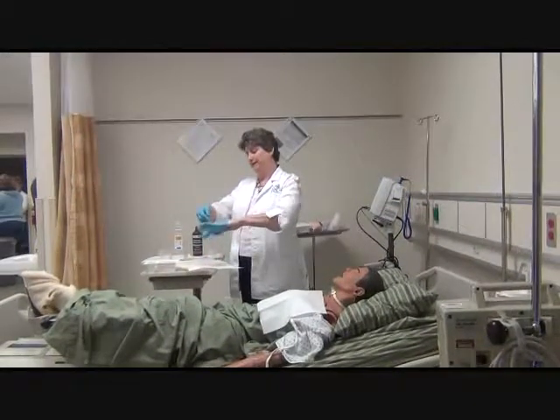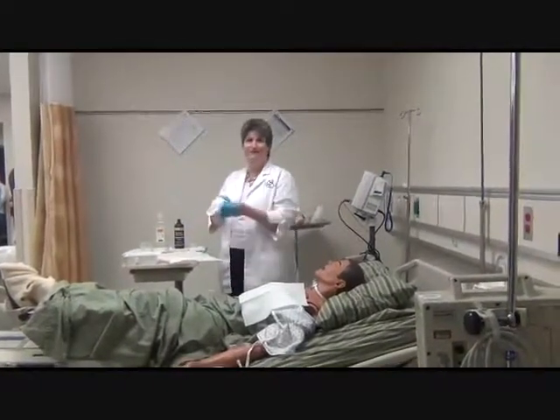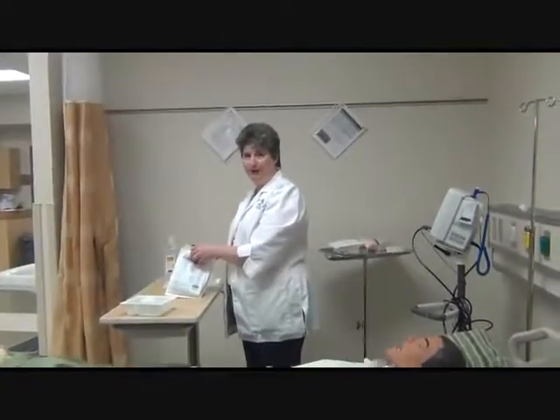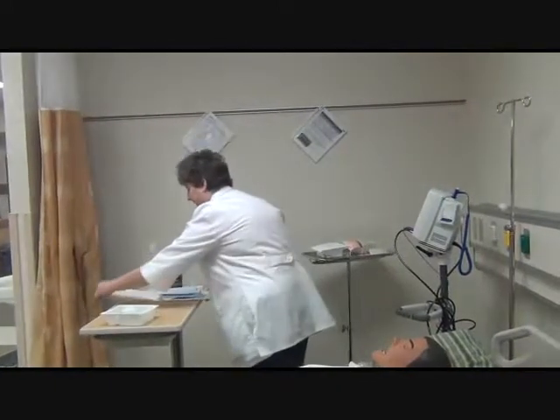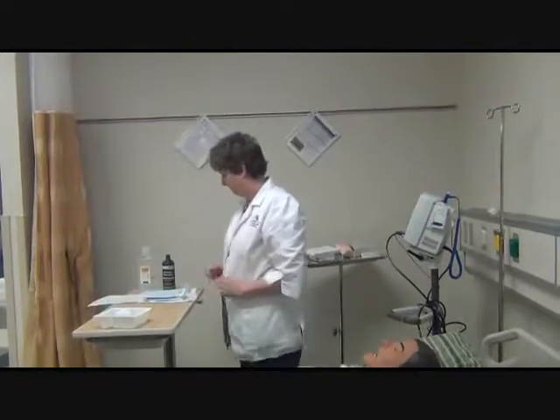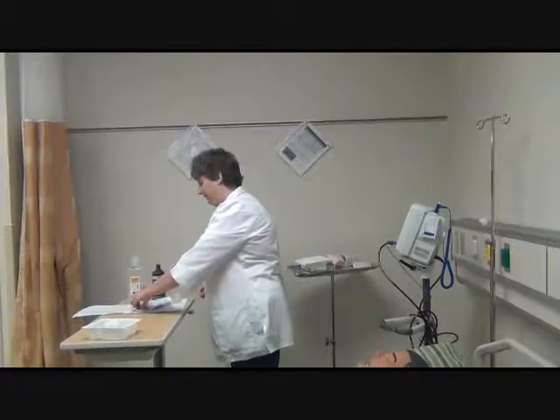I always love it when things are packed backwards, and I contaminated. So let's start over. I'm going to open up my suction catheter kit. This is going to be peeled back. Give it a little pull so that your paper doesn't snap back. Reach inside and pull your gloves out.